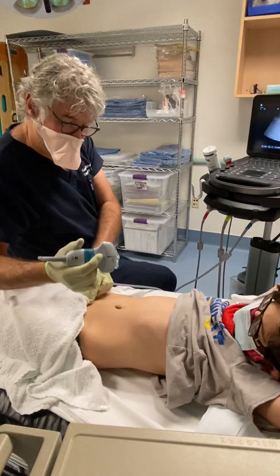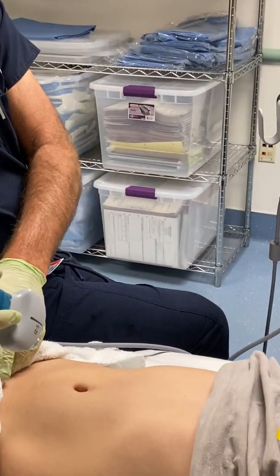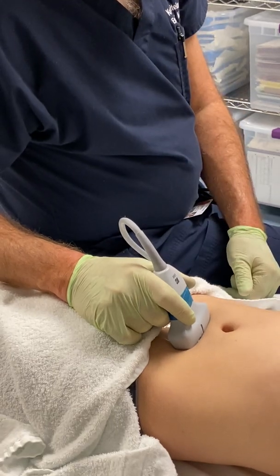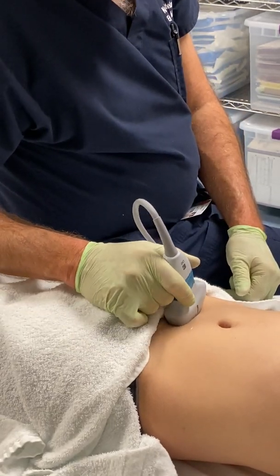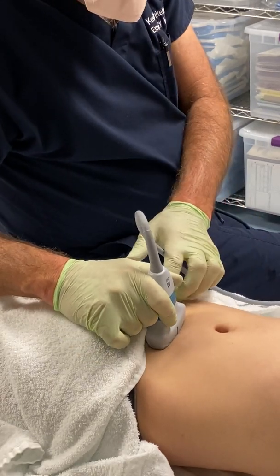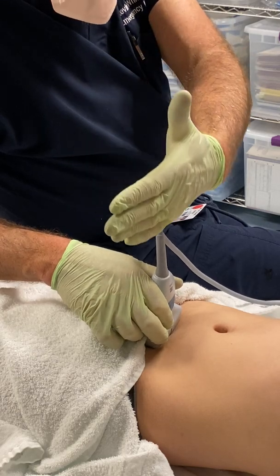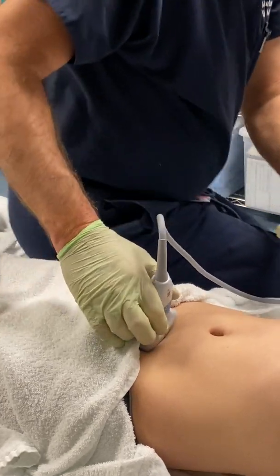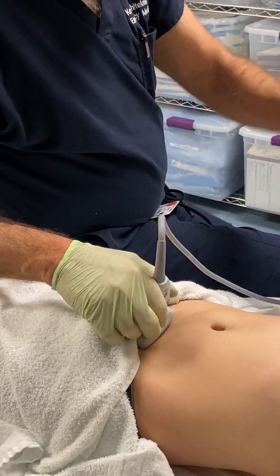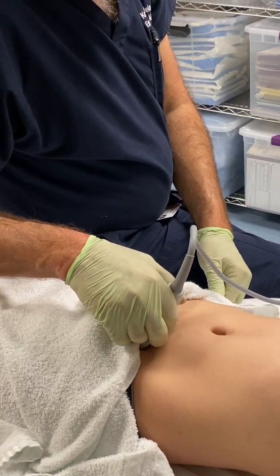When the probe goes on the patient for bladder scanning, it's going to go right at the base of the abdomen, right above the pubic symphysis. If you're too high, you're not going to see anything. Off to the right or off to the left, you're not going to see much either. But get right in the middle with the probe in a transverse position, with the probe marker off to the patient's right — your left — and you're going to see a big rectangular structure. That's the bladder, which is very full right now.